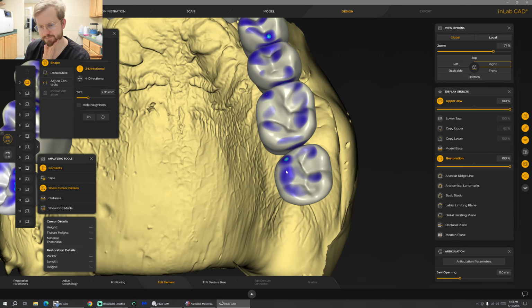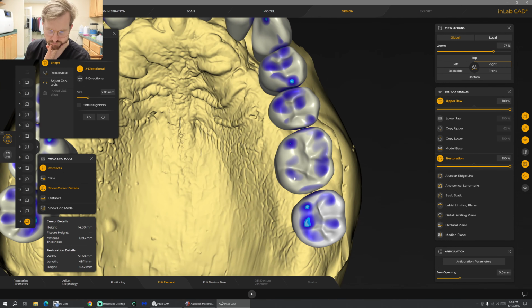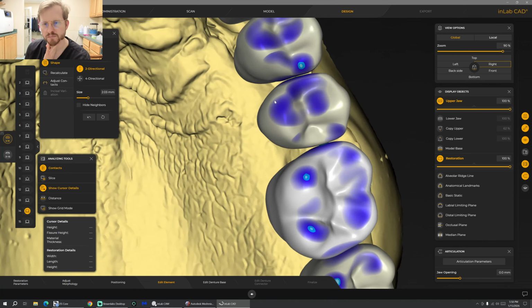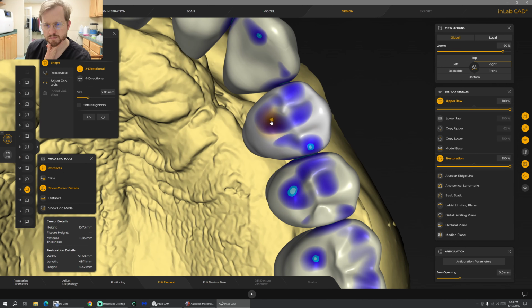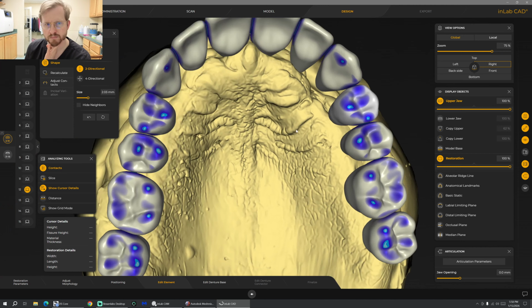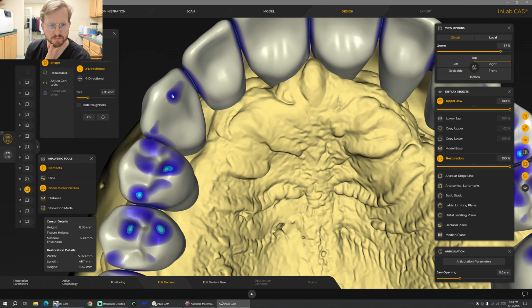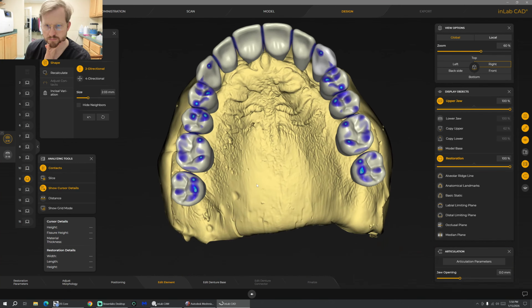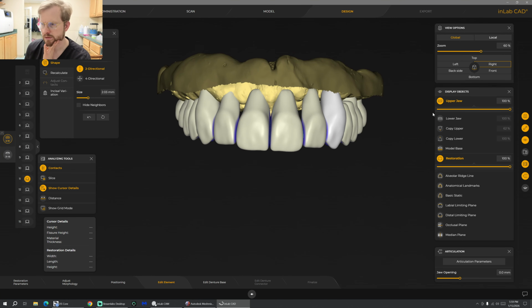Same thing over here. Good. So that looks okay.